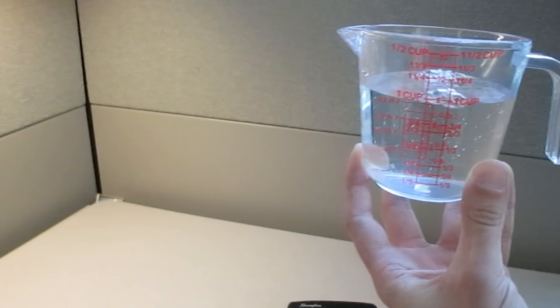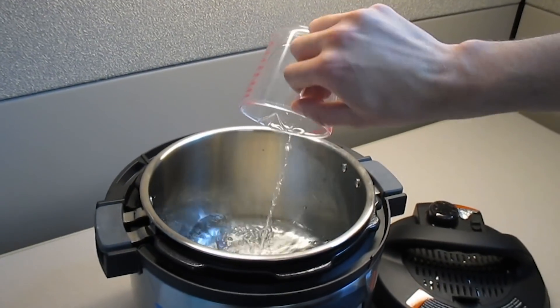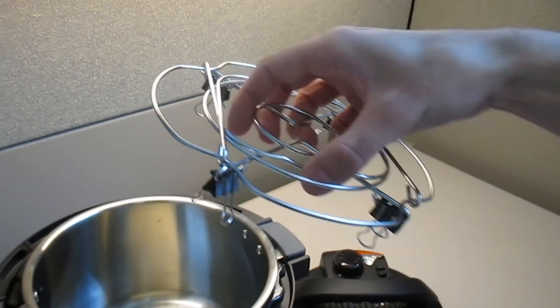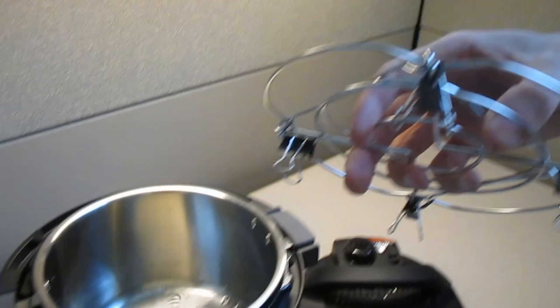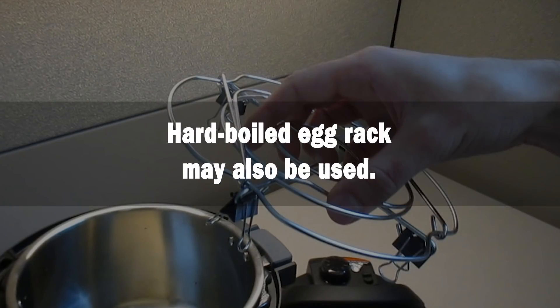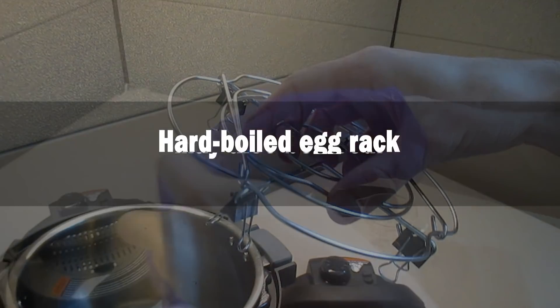With the lid removed from your multi-cooker, add the pre-measured water to the pot. You want the bottom of the pot to be covered with a half an inch of water. Once the water is in the pot, a rack should be placed in the pot such that it will keep the mask and bag above the water. If the rack is not tall enough, you may place binder clips on its feet to increase the height as shown here. Alternatively, accessories such as a hard-boiled egg rack may also be used.